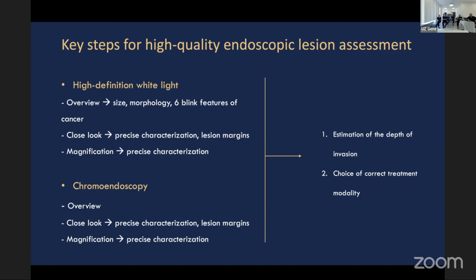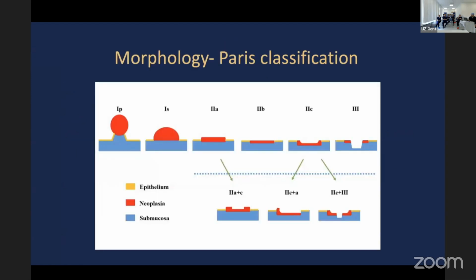Use virtual chromoendoscopy to interrogate an area of abnormality that you think looks abnormal in white light. Maybe it's more red, maybe it's depressed, because how are you going to know the structure if you're not looking at the vascular pattern? And you cannot look at the vascular pattern properly with white light. And that's, I guess, that.